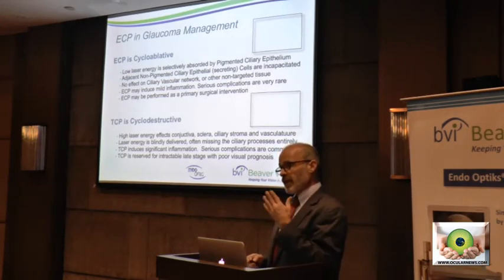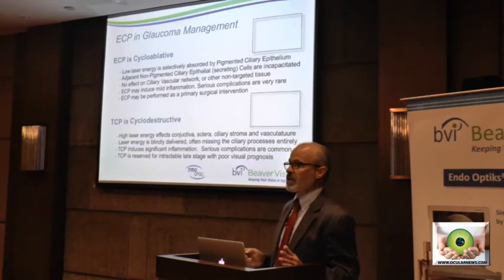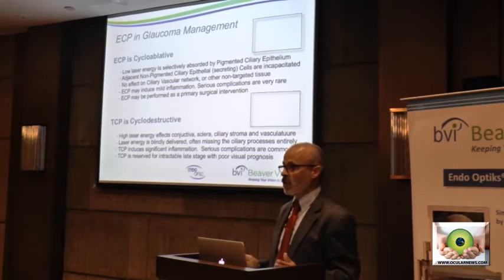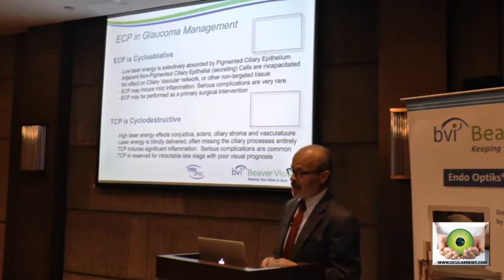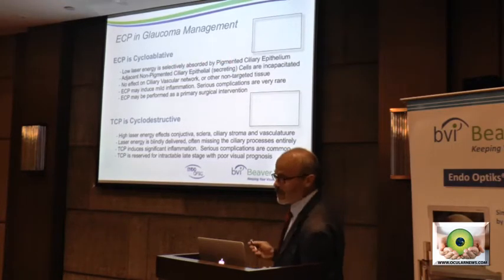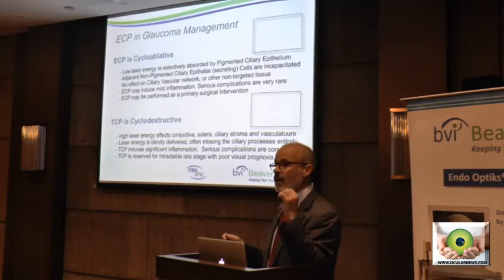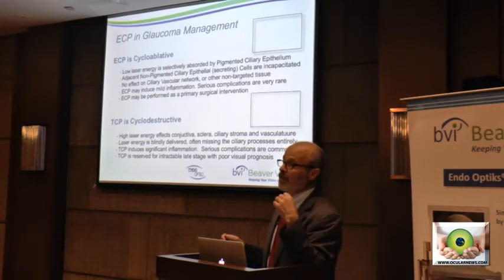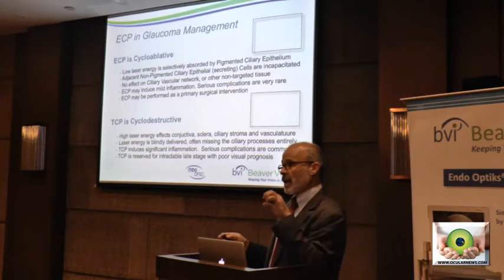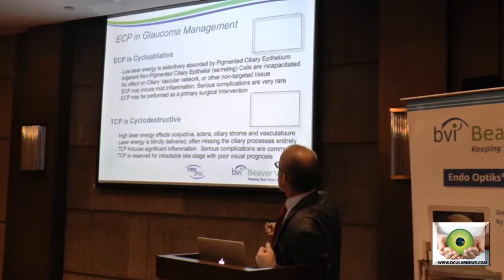So the Professor spoke at length about cyclodestructive procedures. And ECP is often referred to as a cycloablative procedure in that we're not destroying the ciliary body, as is done in cyclocryo and in TCP. We're using very low laser energy, as I'll show you in a moment, selectively absorbed by the pigmented ciliary epithelium. Our target tissue, as you might imagine, is in fact the non-pigmented ciliary epithelial cells. Those are the cells that are actually secreting aqueous, and they are adjacent to these pigmented cells. So by heating the pigmented cells, we are incapacitating the adjacent secreting cells.